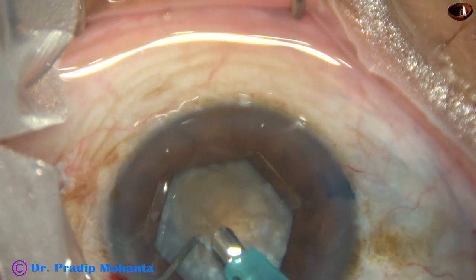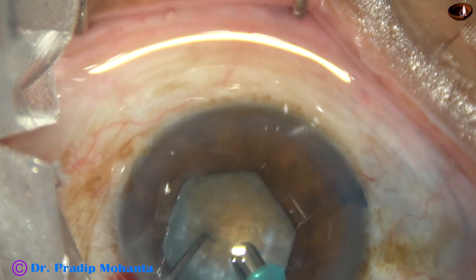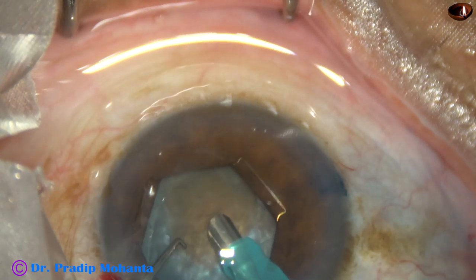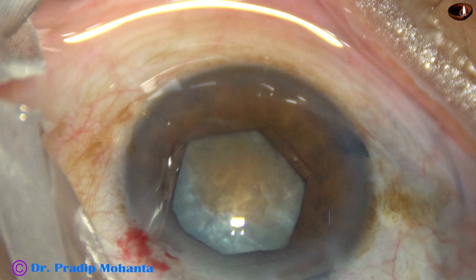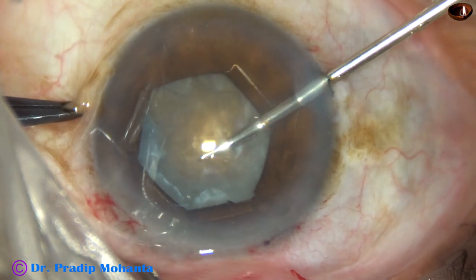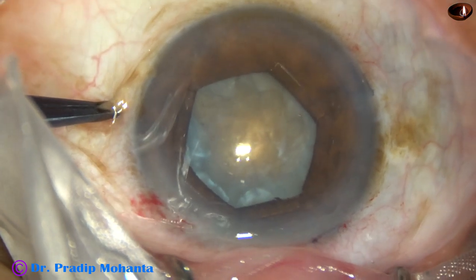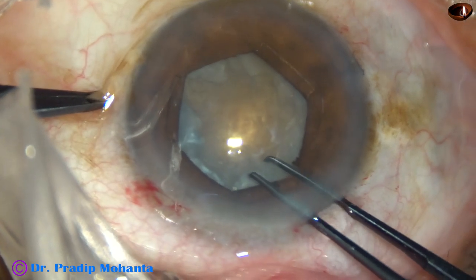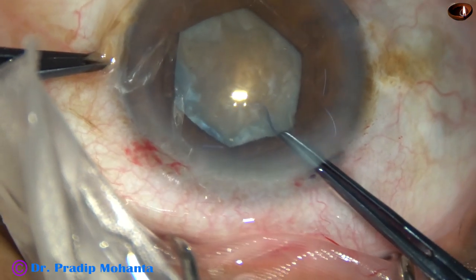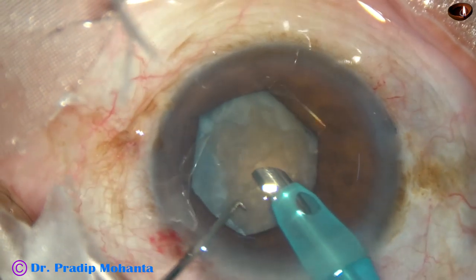As I try to remove some superficial cortical lens matter, I find that the rhexis is quite small for this hard nucleus. I can enlarge the rhexis in the supero-nasal quadrant. So I introduce a scissor, cut the rhexis margin at 12 o'clock, take a Utrata forceps, and enlarge the rhexis in this area. Then, injecting viscoelastic, I go again with the phaco needle into the anterior chamber.